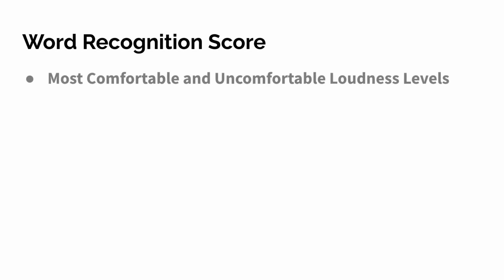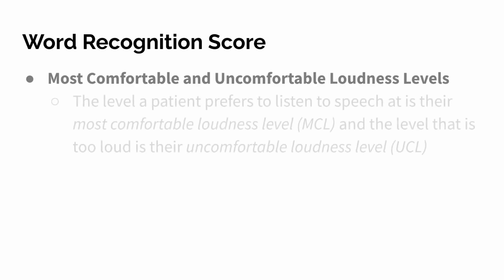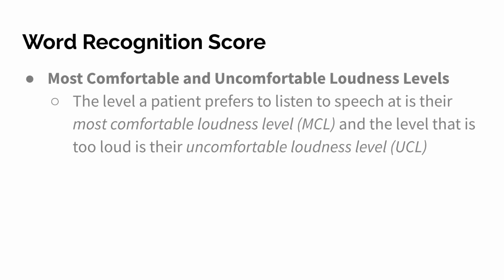Let's briefly talk about most comfortable loudness and uncomfortable loudness levels because they will come up. We'll come back around to selecting the ideal presentation level for PB max, but let me take a detour here.